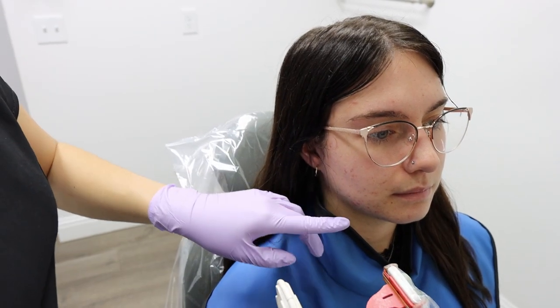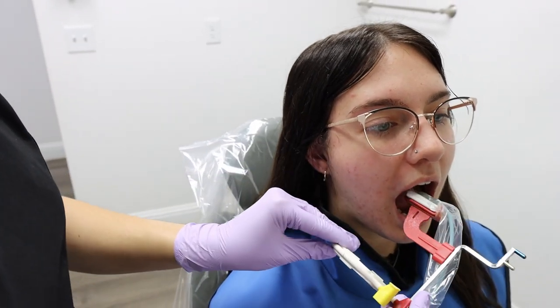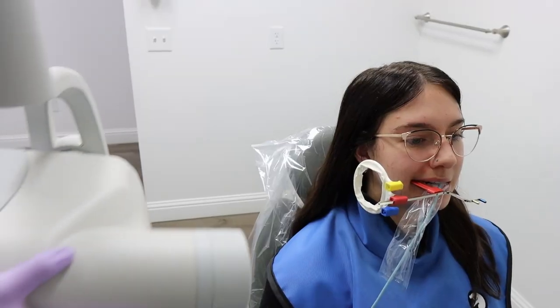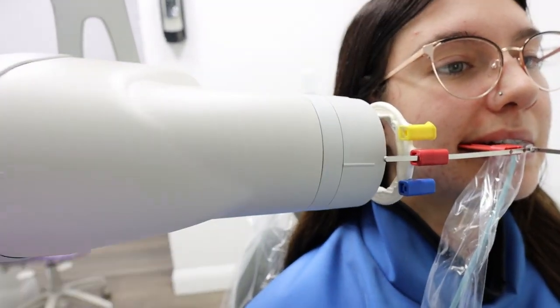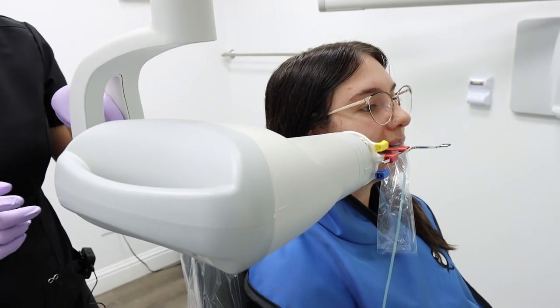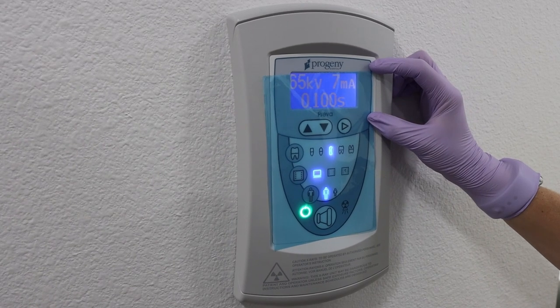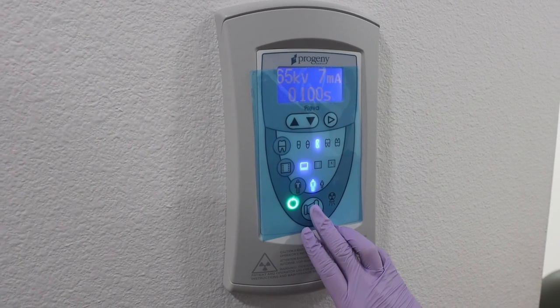We're going to start on the molars on the right side. Instruct the patient to open, and when you place the sensor in, you're going to angle it up, place it all the way in the back, and instruct the patient to bite down. Then you're going to position the sensor to line up with the ring, and you also want the x-ray head to be angled down to 10 degrees to ensure open contact. To take the x-ray, press and hold the bottom button until you no longer hear the beep.